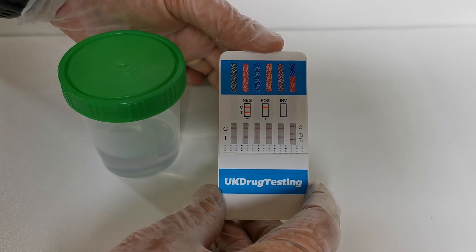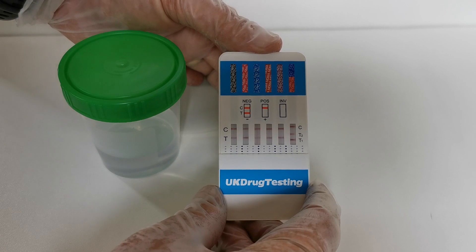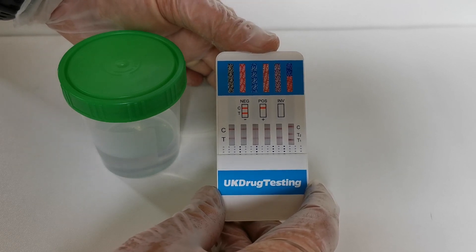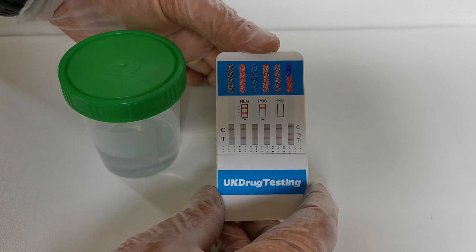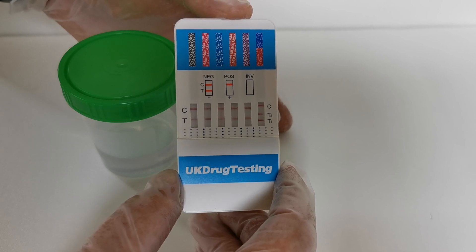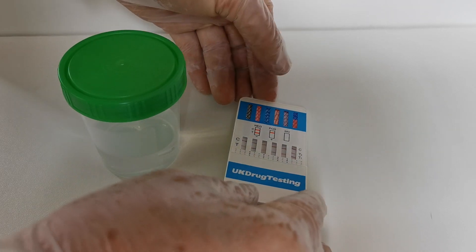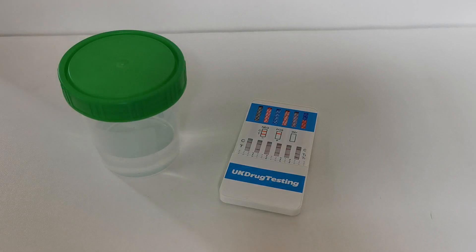A present test line indicates a negative result. If there is no test line showing at ten minutes in the presence of a control line, that is a presumptive non-negative or positive result, and that needs further interpretation to find out why it is not negative. As you can see in this example, all the test lines are present — this is a completely negative sample result. Very easy to do, very clear and easy to interpret. This is the UK drug testing seven panel combination, which includes some ultra sensitive test membranes screening at the industry cutoff levels currently available for rapid testing.